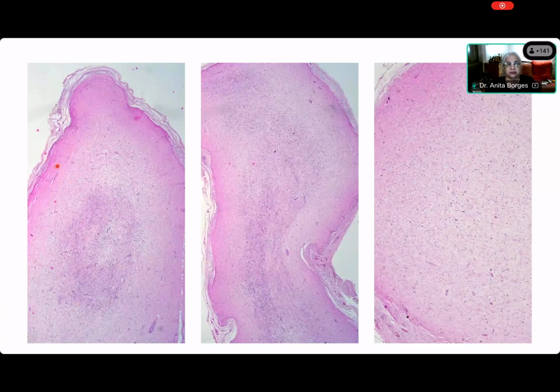You see very dense pink areas, eosinophilic areas at the periphery, which suggest that there must be collagen over there. And as you come towards the center, you see less and less pink until it becomes actually blue. Do you see this or not? Yes, ma'am, I can appreciate it. That's what has to be appreciated. The pink has become less pink and then it has become blue, which tells you that this lesion has got degrees of collagenization and myxoid change that you can see.